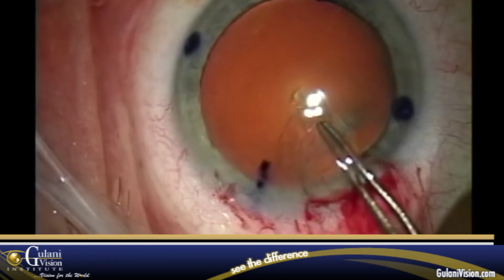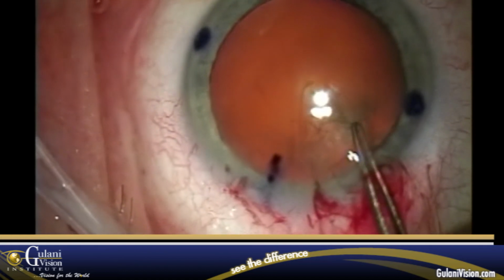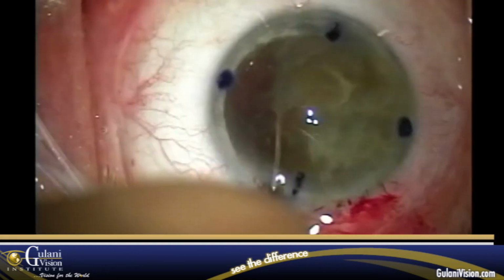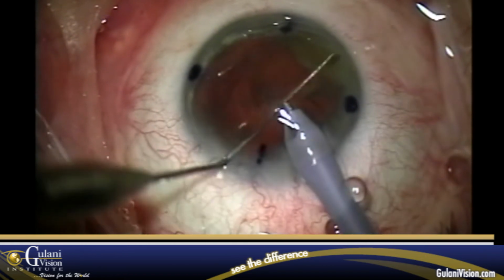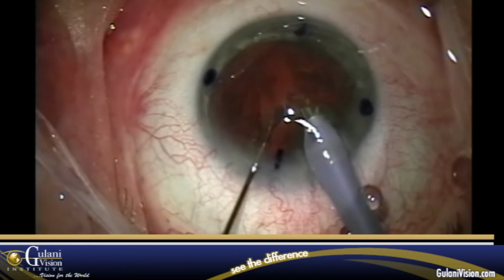You can see the edge of the rhexis as I keep moving the eye around and seeing it from different angles to a full successful completion. Inject viscoelastic behind the prolapsed nucleus to protect the bag. Using the same principles, keeping the phaco tip stationary, feed the cataract with the second instrument.